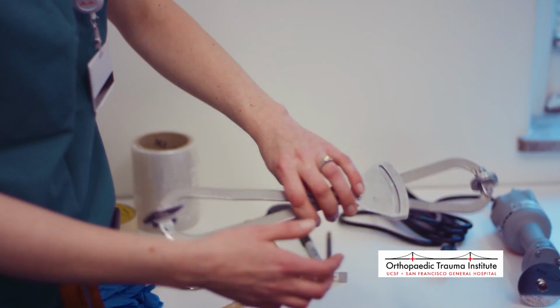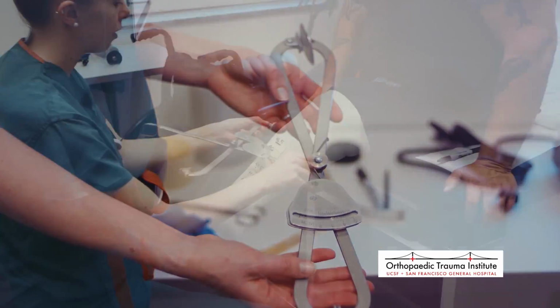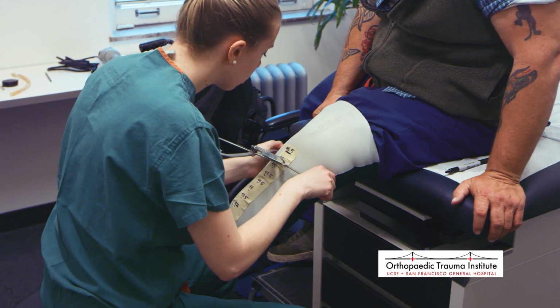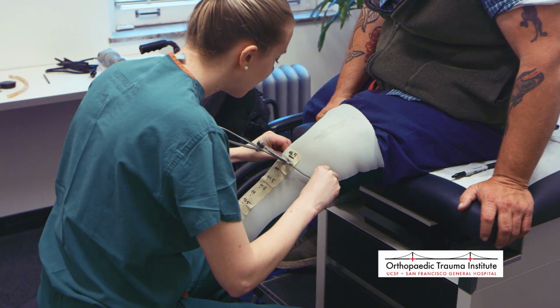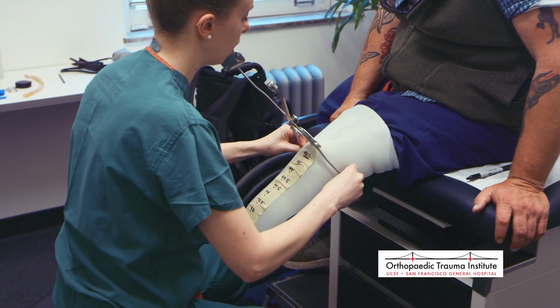This contraption is a little bit old school. It measures the front and back of the knee. And these dimensions are really important to maintain a stable socket fit. So we monitor these measurements over time.